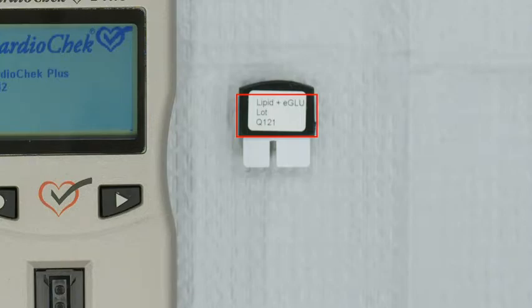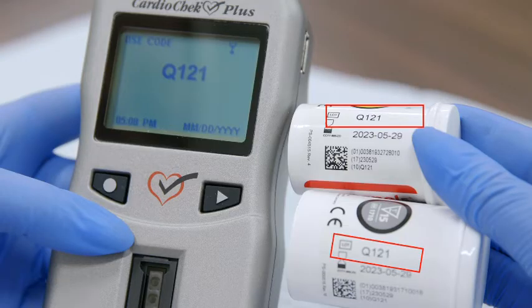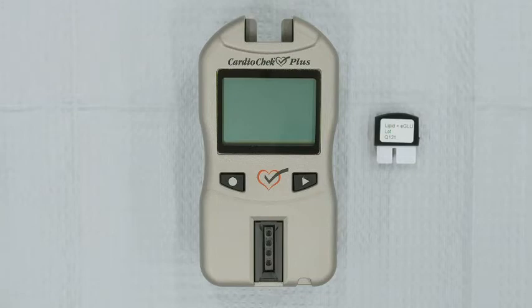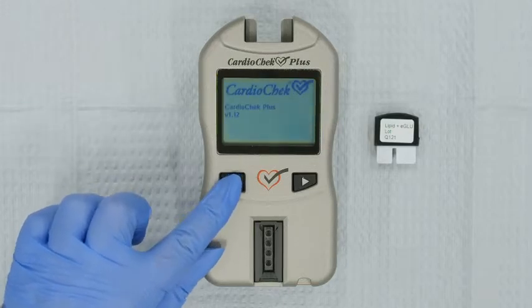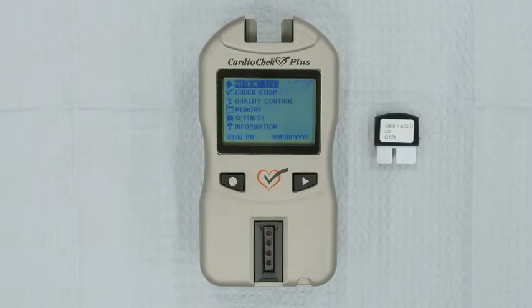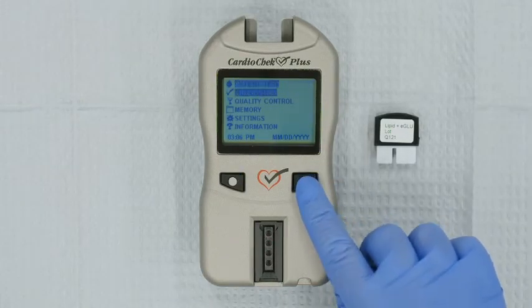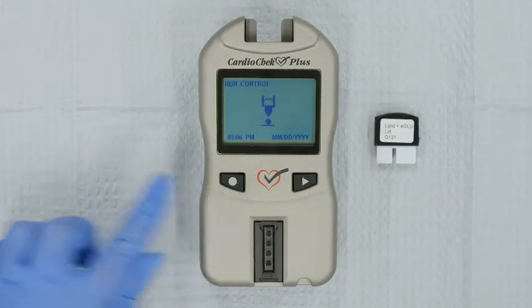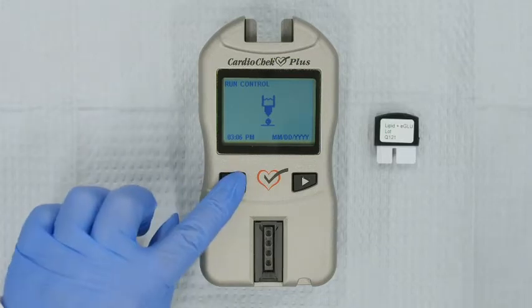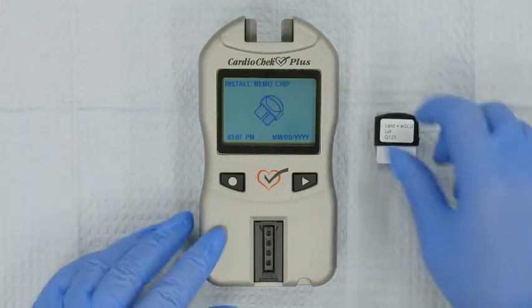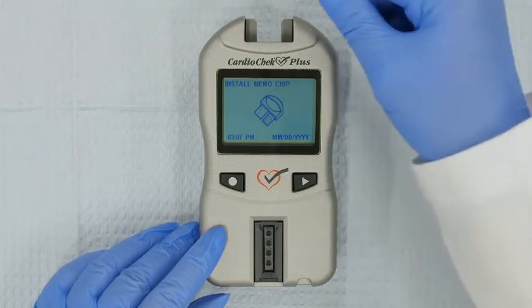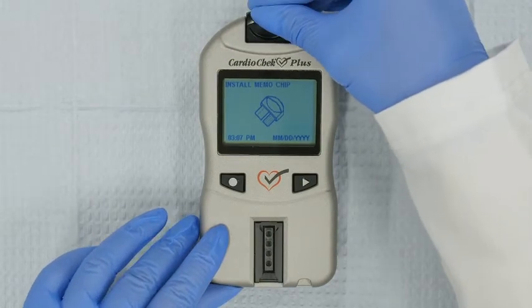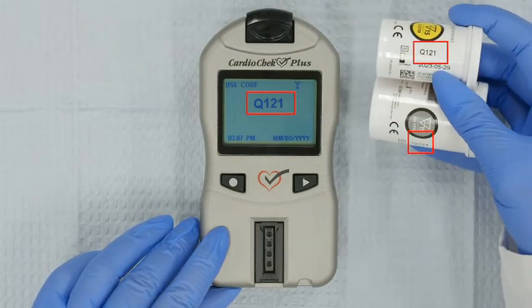Check the expiration dates on both the PTSPanels Test Strips and the control materials to make sure they have not expired. Make sure that the Memo Chip lot number and the Test Strips lot number match. Make sure the analyzer is on a flat, stable surface. Turn on the analyzer by pressing either button. Press Next until Quality Control is highlighted in the main menu, then press Enter. Run Control will appear on the screen — press Enter. Install Memo Chip will appear on the screen. Insert the Memo Chip into the Memo Chip port. Make sure that the lot number on your analyzer display and the Test Strips lot number match.